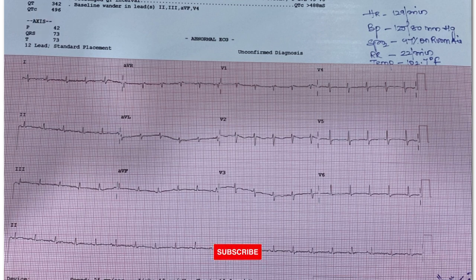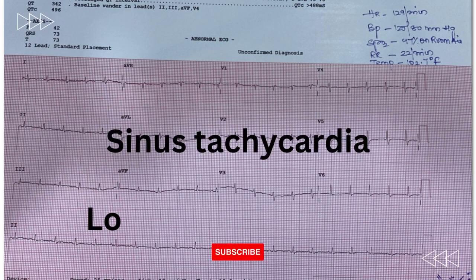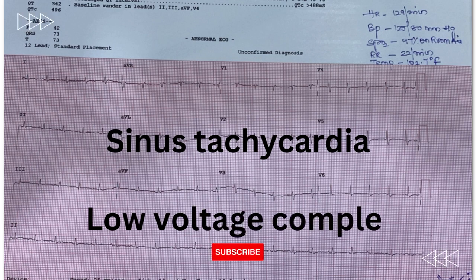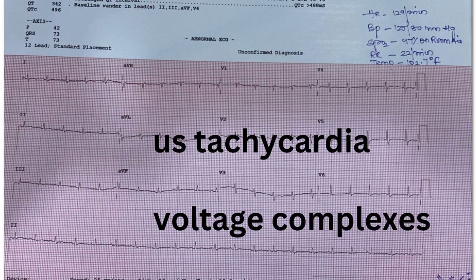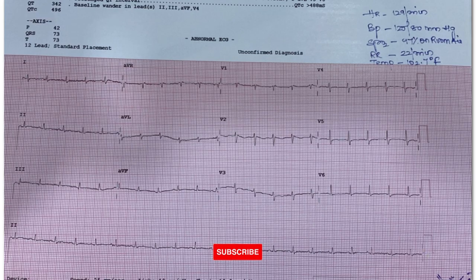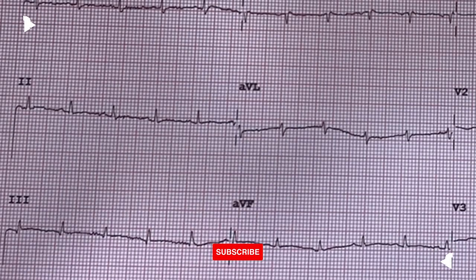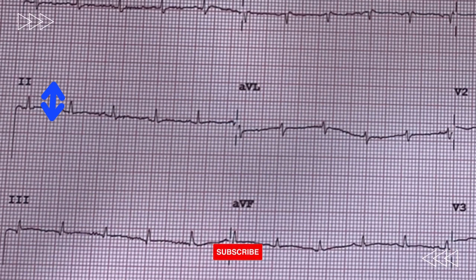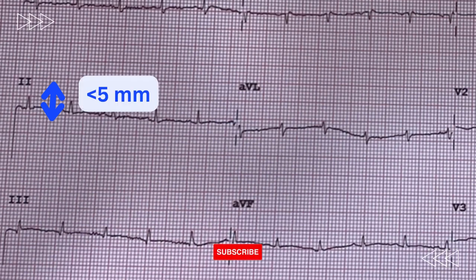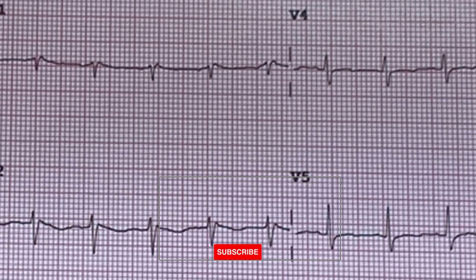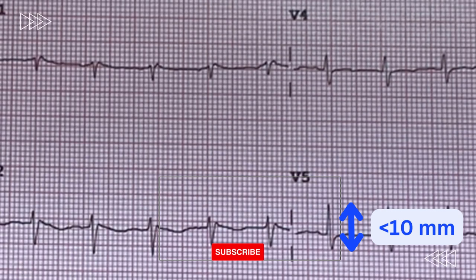This electrocardiogram shows sinus tachycardia with low voltage complexes in both limb and chest leads. The QRS is said to be low voltage when the amplitudes of all the QRS complexes in the limb leads are less than 5 mm, and the amplitudes of all the QRS complexes in the precordial leads are less than 10 mm.